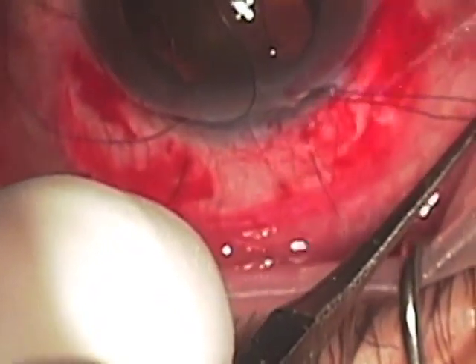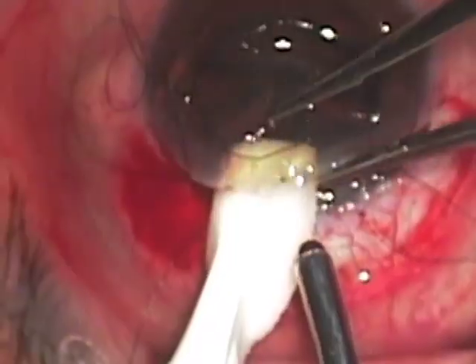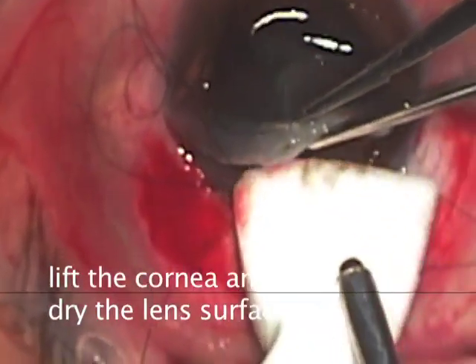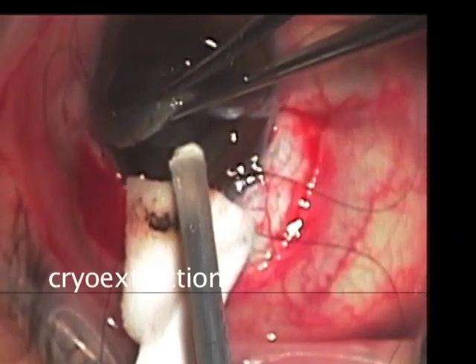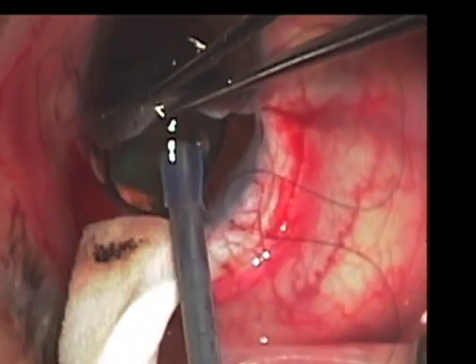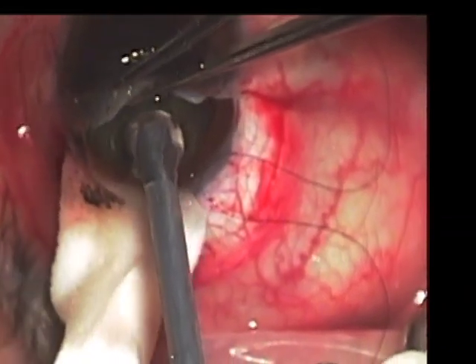Before we remove the lens, we have to extend the incision left and right between the loops of the suture. This allows the assistant to lift the cornea while the surgeon using a Wexcel sponge dries the lens surface, which allows the cryoprobe to stick to the lens. In this case, some vitreous comes forward and still the cryoprobe sticks to the lens because the interface between the two was dry.